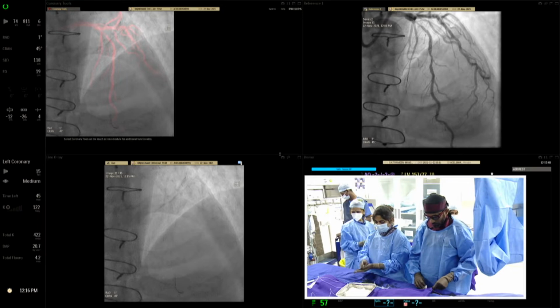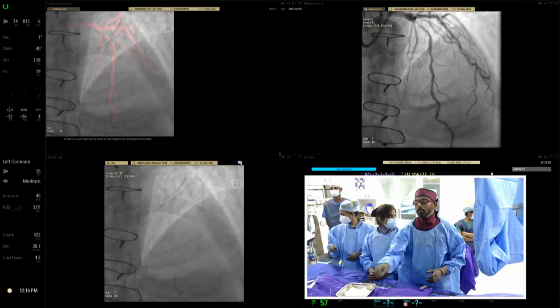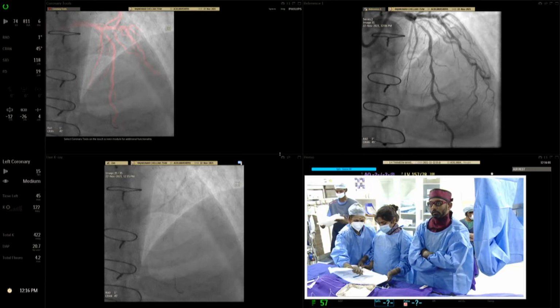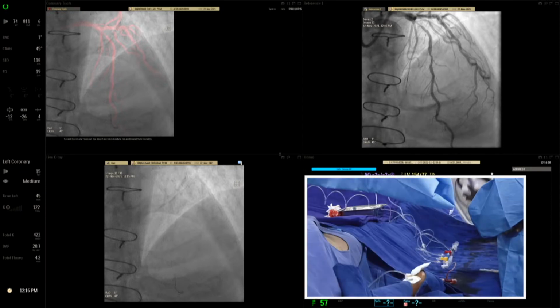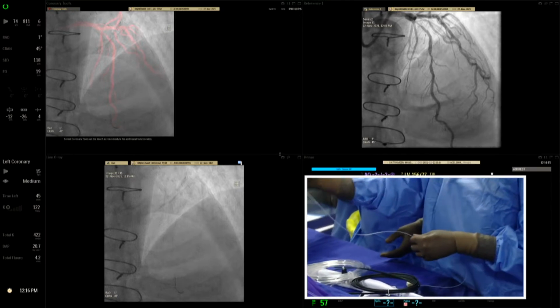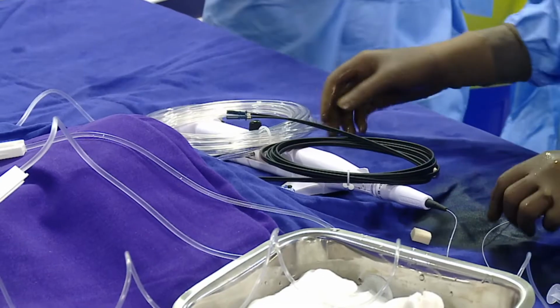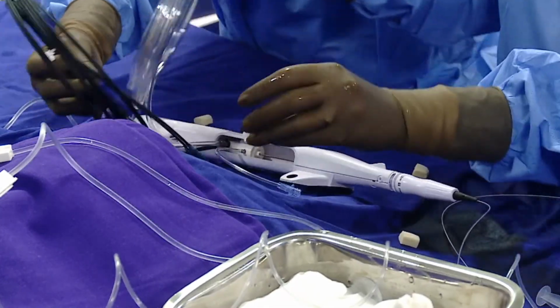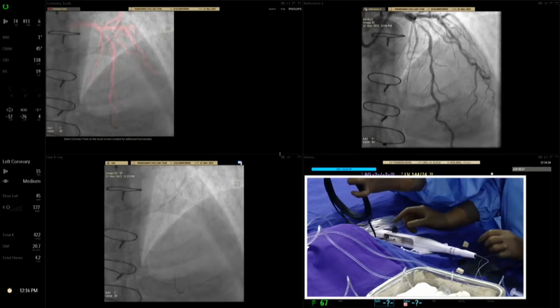temporary pacemaker wires for rotablation because most of the times we can get away with doing atropine injections if needed, or a very short duration. So if you reduce your rotablation time to 10 to 15 seconds, the chances of going into significant, prolonged bradycardia is quite low, and therefore we don't need to routinely use temporary wires for rotablation as we used to do in the past. But nevertheless, I do tend to keep atropine ready in case there is any bradycardia, to make sure that the heart rate gets better.